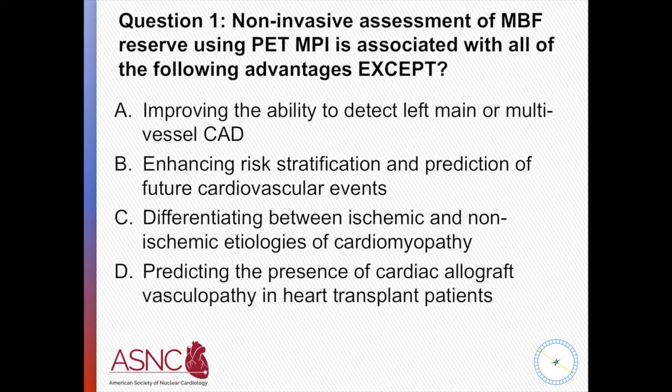Yeah. So I think that's one very important advantage of PET. Our interventional colleagues in the old days used to complain about false positive nuclears. Now the biggest concern that they have is underestimation of disease extent, which presumably is why that knee-jerk response that any abnormality on a perfusion study gets a patient into the cath lab. So this can be very helpful in many cases in determining whether a patient really does need to be in the cath lab or could potentially be managed medically.